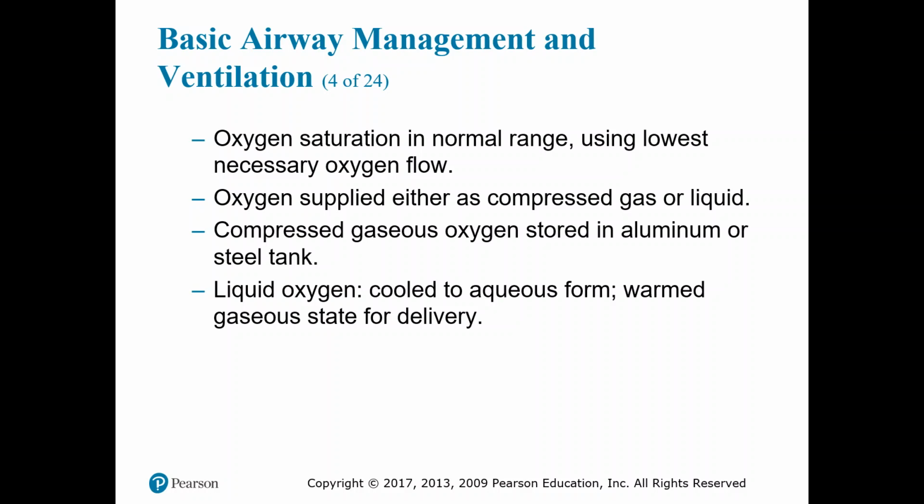Liquid oxygen is cooled to a liquid form and warmed back up to its gaseous state for delivery. Although liquid oxygen requires less storage space than an equal amount of compressed gas, you must keep it upright and accommodate other special requirements for its storage and transfer. The regulator for an oxygen tank is either a high pressure regulator, which is used to transfer oxygen at high pressures from tank to tank, or a therapy regulator, which is what most of us deal with, which is used for delivering oxygen to patients.